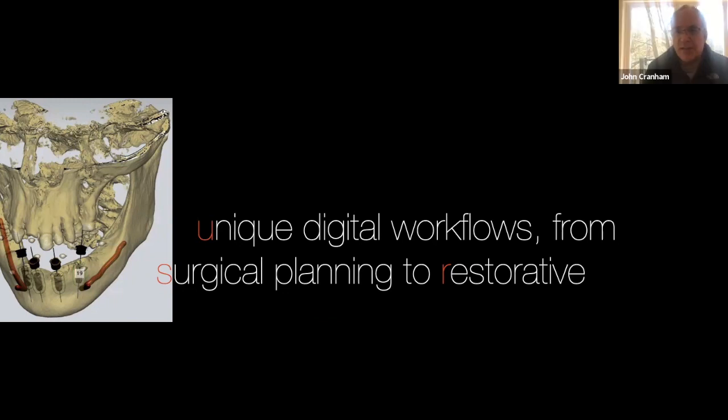I would just tell you, and again, I think trying to scan inside the mouth is really tough. Edentulous areas. Maxilla is easier, but the mandible, and the place that's really tough is if you think about the extension in the retromolar or retromylohyoid, below the tongue. I mean, trying to get a scanner all the way down in there to proper extension is difficult.